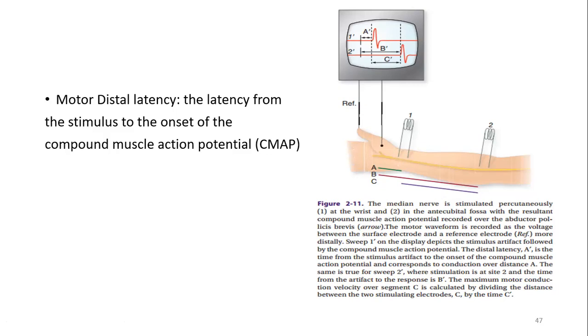That is what we call the distal latency, between the stimulation and the generation of the action potential. This distal latency is important in assessing the function of the peripheral nerves. In demyelinating neuropathies, diseases which affect the myelin sheaths of the nerves, this distal latency is usually prolonged, while in axonopathy, or disorders of the axons, the distal latency will not be affected unless the disease is significant or at late stages. So this is one thing I want to say about this latency.